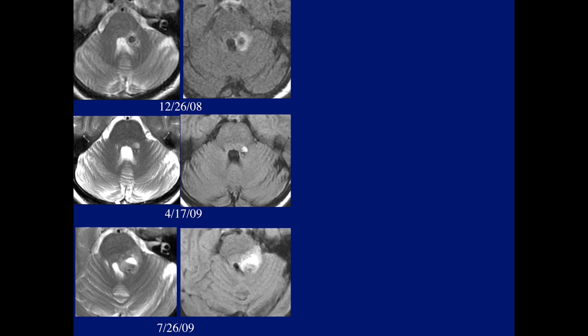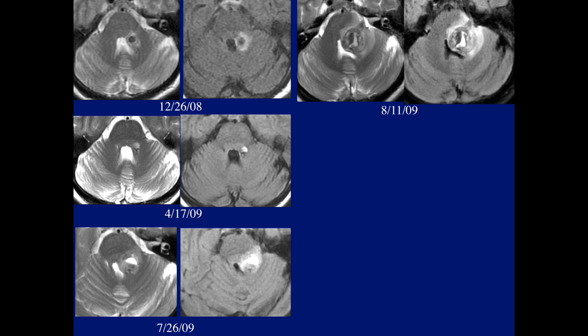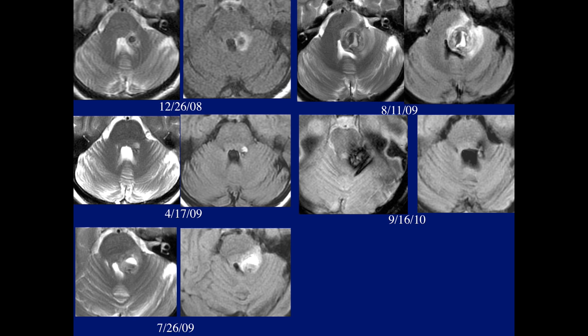We see now a larger hematoma deforming the fourth ventricle. Here's a follow-up a few weeks later, with even further expansion of the hematoma in the brainstem and involving the pons as well. And this is now a month later — a year later — and we can see a large amount of hemosiderin and the residual of the hematoma.